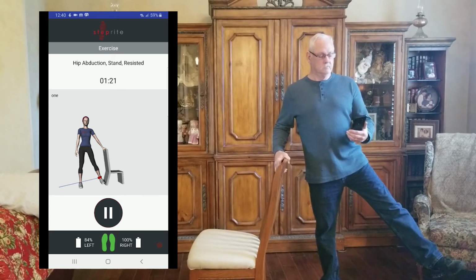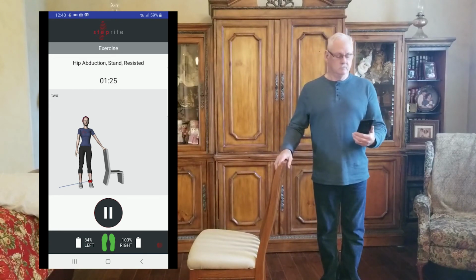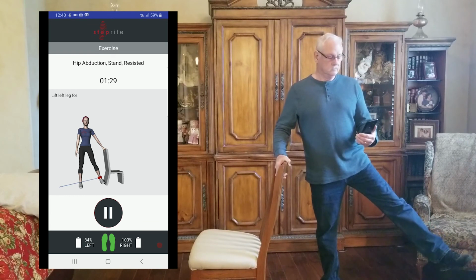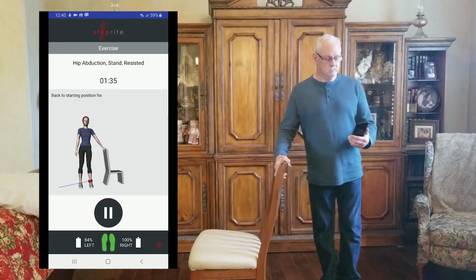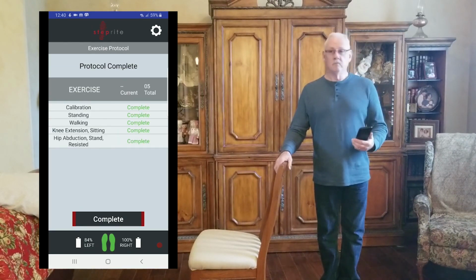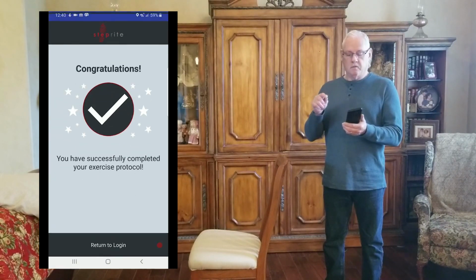In this case, it's 3 simple hip abductions out to the side. You can see in this case the patient is doing the left leg. Of course, after these 3 exercises are complete on the left leg, you would have the ability to hit the continue button to then do the right leg, as that serves as a comparator for the provider to make clinical judgments. When the entire exercise is complete, click and it's done.